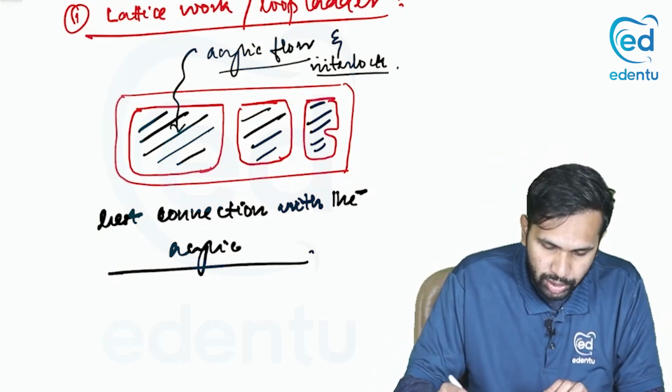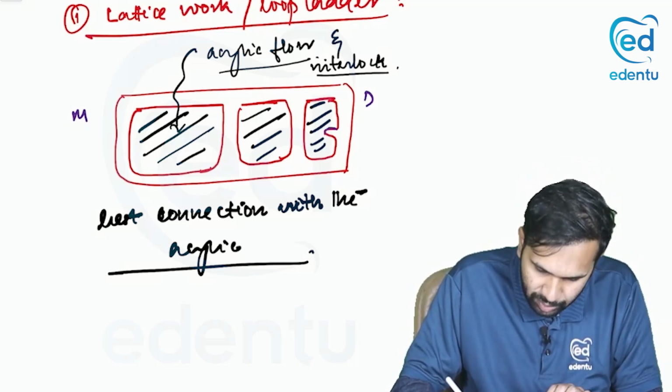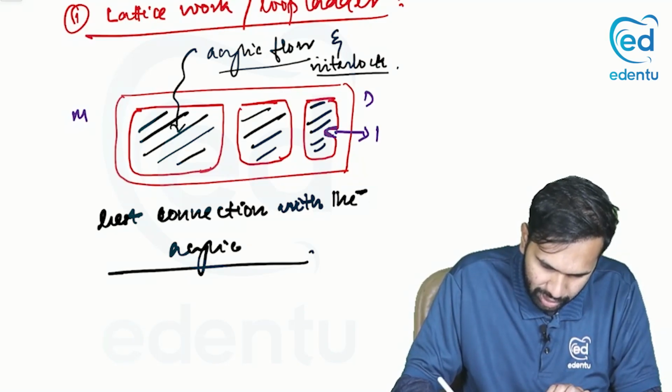And at the distalmost extent, this will be mesial and this will be the distal side. You can see a small projection. This is nothing but a tissue stop.